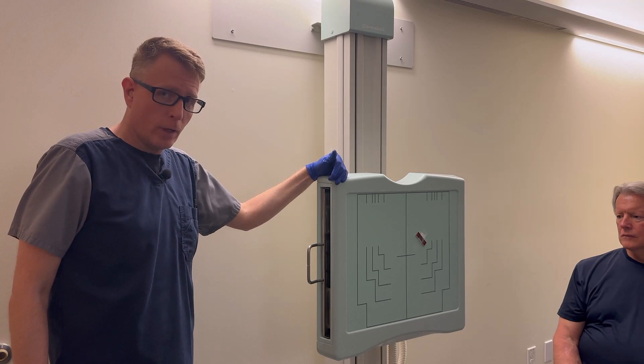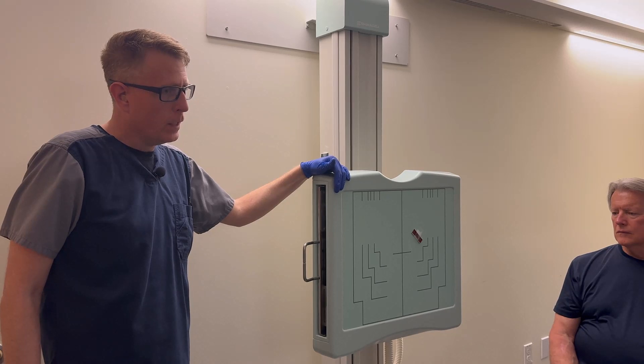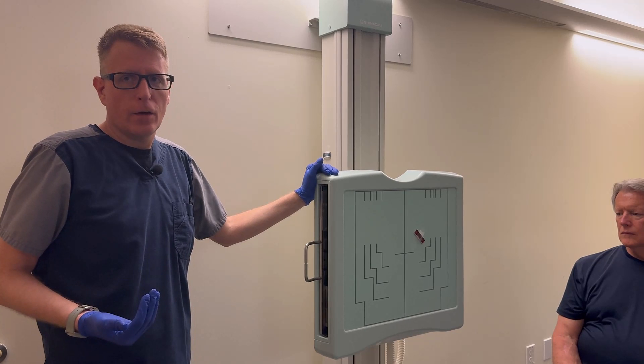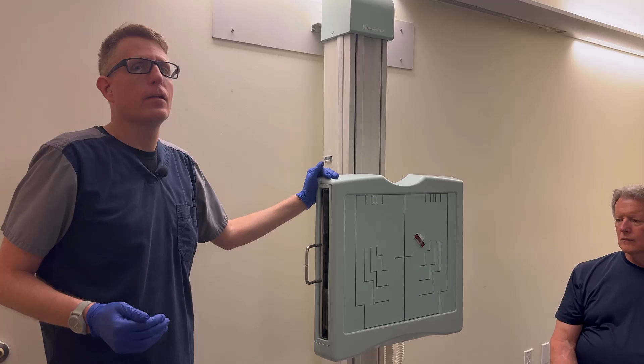If we put the patient's OML lined up against the Bucky perpendicular, that angle is going to have centering around the nasion area. But we're going to raise the chin a little bit — 15 degrees — so pretty much you're going to have your patient's nose right against the board.